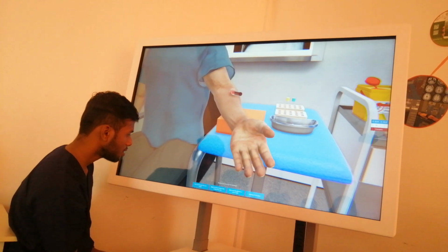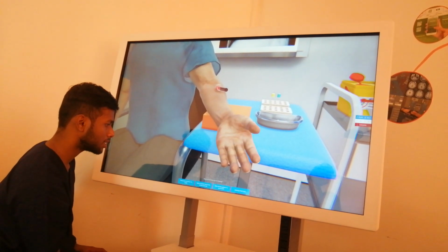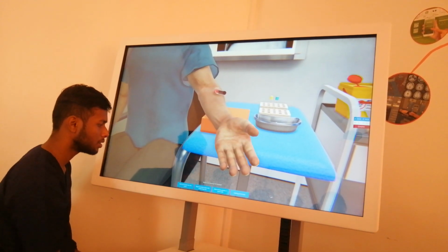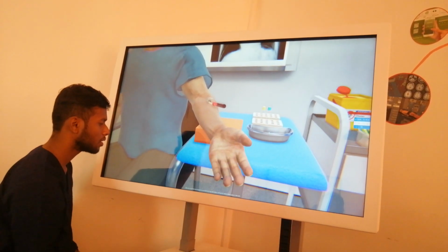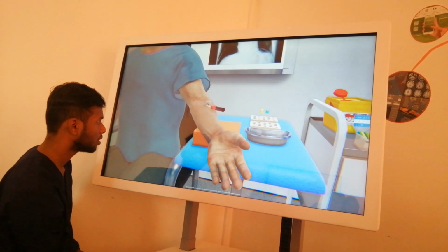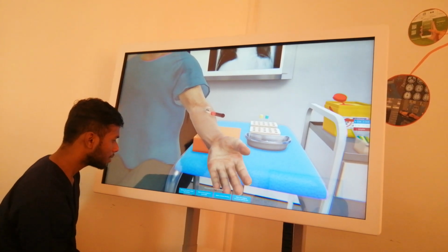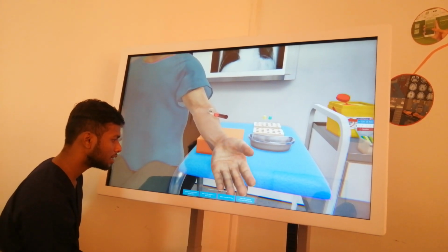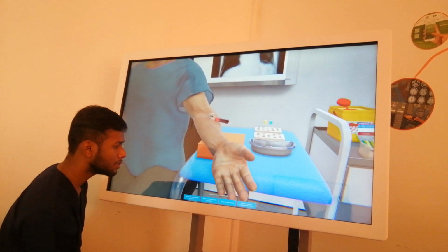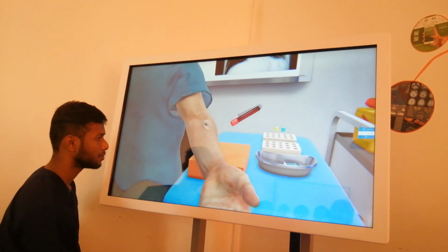What process should be the following? Remove the tube from the holder. Apply an alcohol wipe to the vein puncture site. Make sure the patient is in good health. Labeling of test tubes. After the blood flow has stopped, remove the tube from the holder, leaving the needle holder system in the vein. What process should be the following? Remove the vacuum system from the vein. Make sure that patient is in good health. Apply a pressure dressing. Make a few wiggling movements with the tube. After removing the tube, make a few jiggling movements.